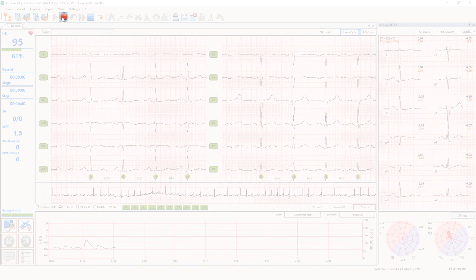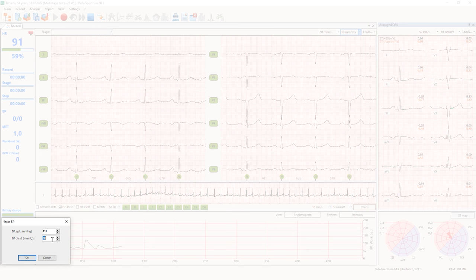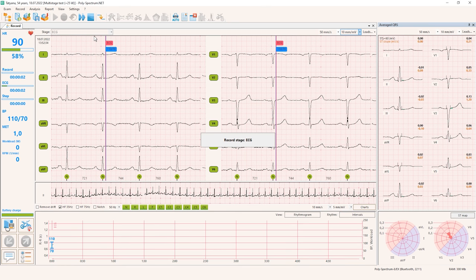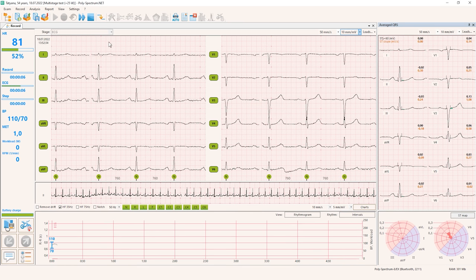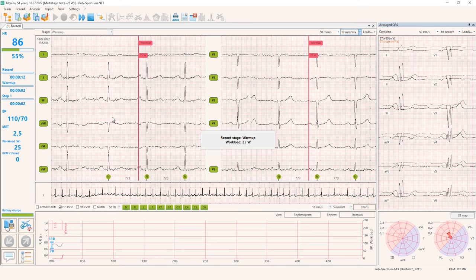I can start recording. I need to input blood pressure data here. A special window appears on screen. Here is the resting ECG, about 10 seconds. This ECG will be used as a reference, so we are recording it in the same patient position as in the following test.